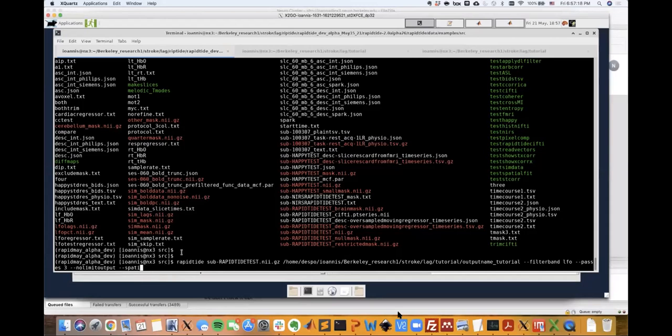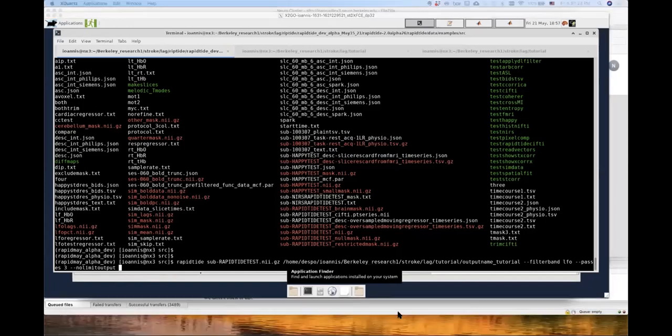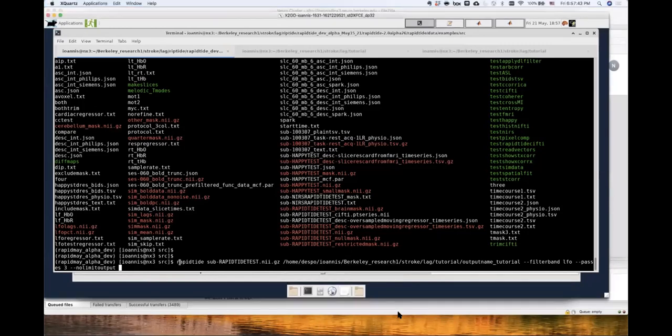Now, with respect to the calculation of the regressor, with which basically all the cross correlations are going to happen, there are a couple of options that are worth mentioning. As I mentioned before, the way that rapidtide is doing cross correlation in its very basic form is using the global signal as an initial regressor that's basically going to keep getting refined. The two following arguments can give you some flexibility with respect to that.